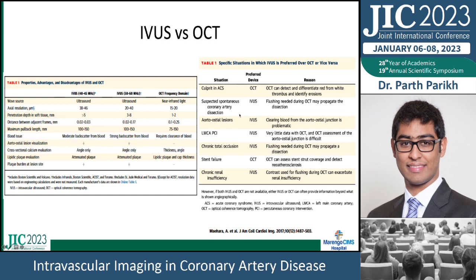Again, we can see this article kind of just summarizes which kind of lesions can be seen better with OCT versus IVUS.